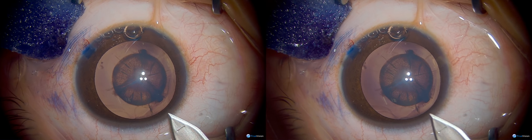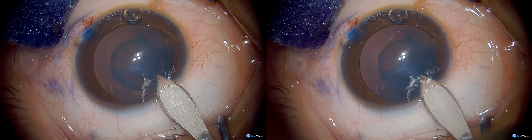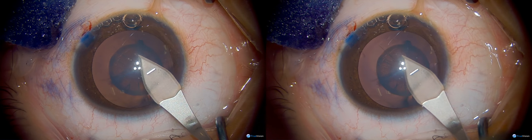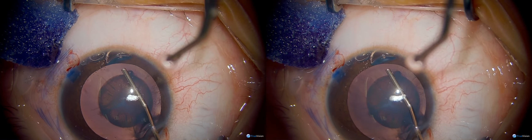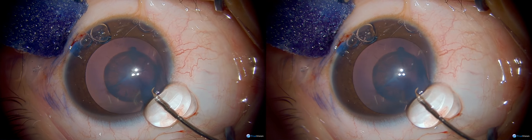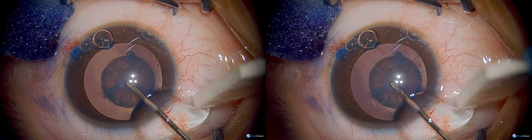Now the primary surgical wound is being created with the keratome — you can see it's being done clear corneal, just anterior to the limbal blood vessels — and then using a highly cohesive viscoelastic to keep that anterior capsule flat, and a bent tip needle cystitome to initiate our capsulotomy, which will then tear 360 degrees.